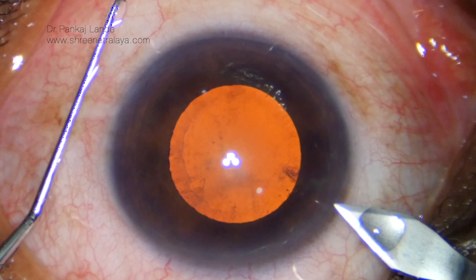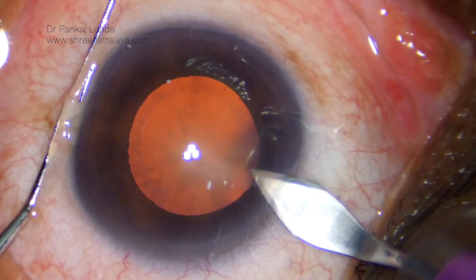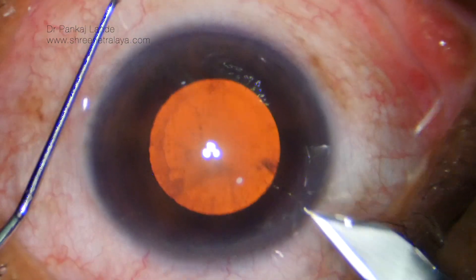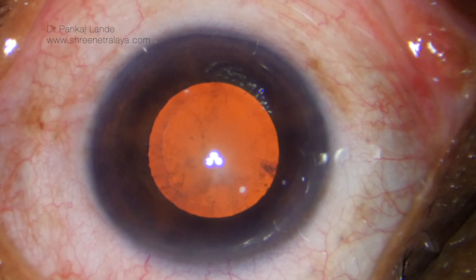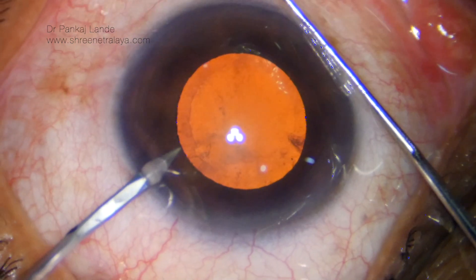Hello friends, welcome to Suryanitarale. In this case we will show a step-by-step phacoemulsification procedure in a mid-dilated grade 2 cataract. The main incision is 2.6 millimeters and the side port incision is 23 gauge.